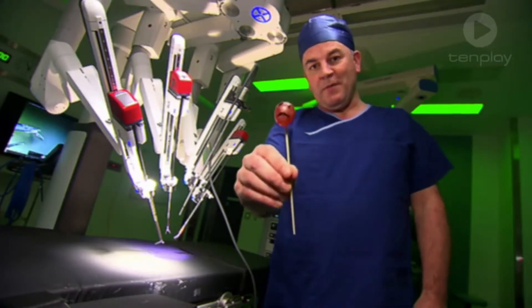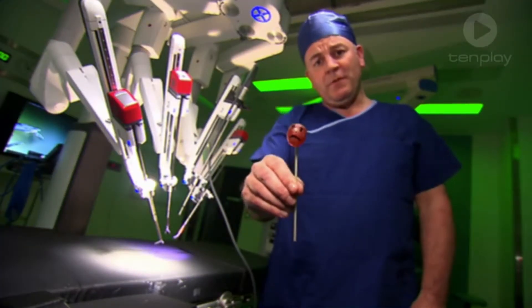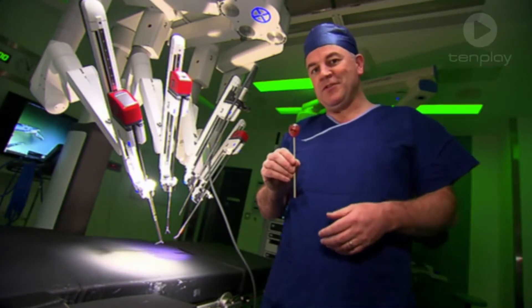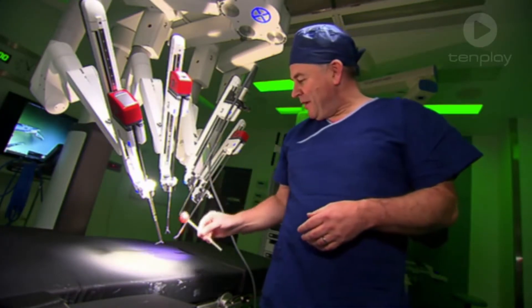Our patient today is Grapey McGrapeface. Grapey hasn't been feeling very well recently, but not to worry — our surgery robot is going to do an operation and he'll be feeling better in no time.